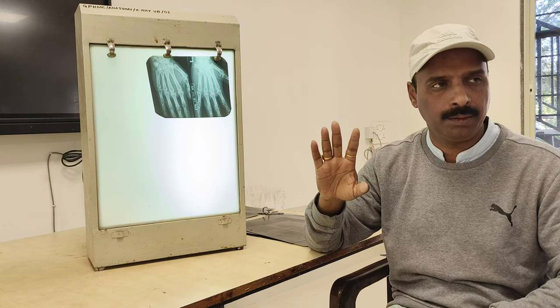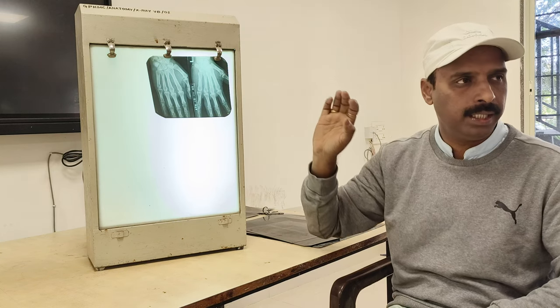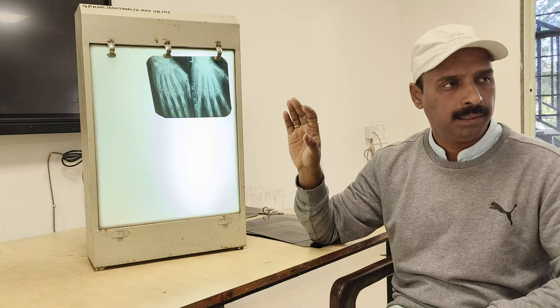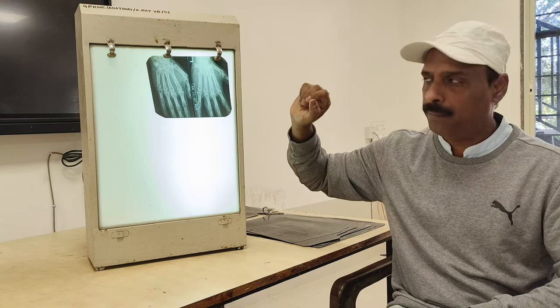But the wrist joint is included, along with total involvement of the hand. So how to read this x-ray? This is a plain x-ray of the hand, which is showing the lower end of the radius and ulna.